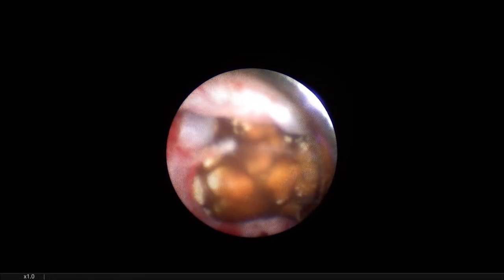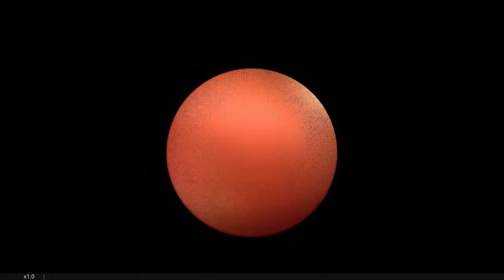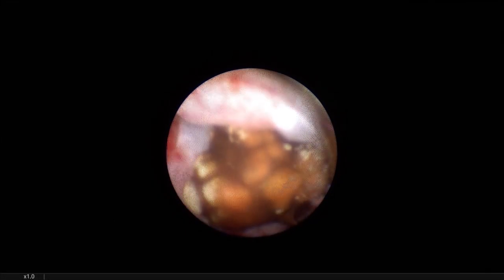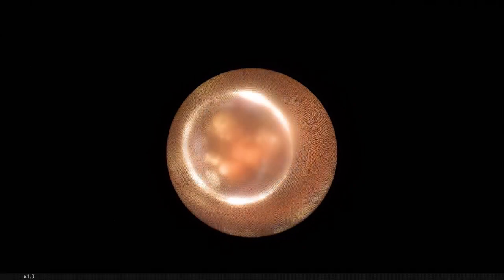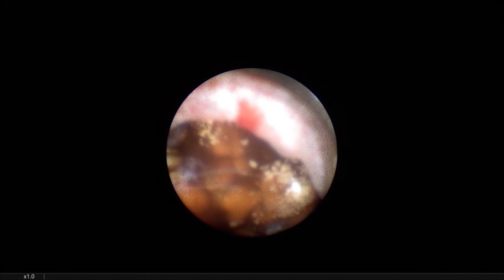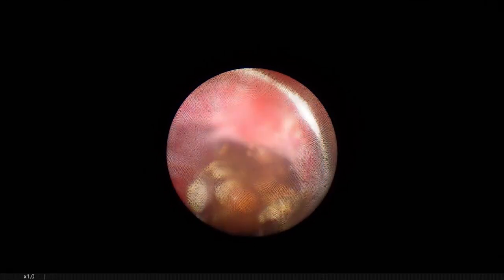Is it ready? 700. Is it ready? 0.7. Just a moment. Okay, it's okay. No, the view is not okay. It is only acceptable, but not good. Okay. This is only to try the hardness of the stone.